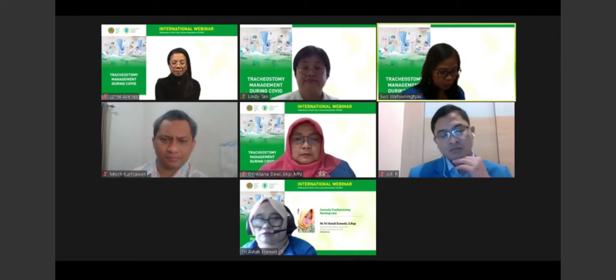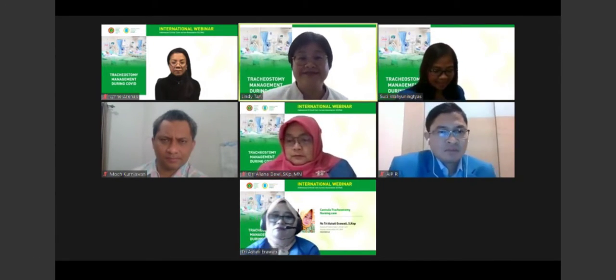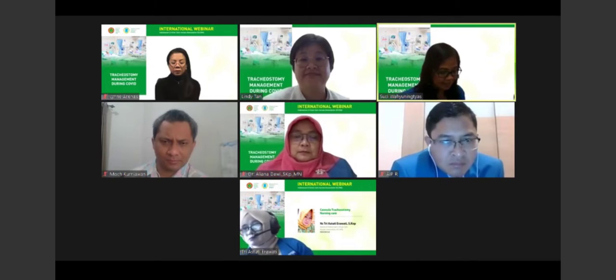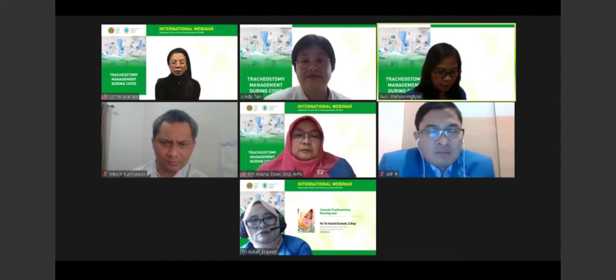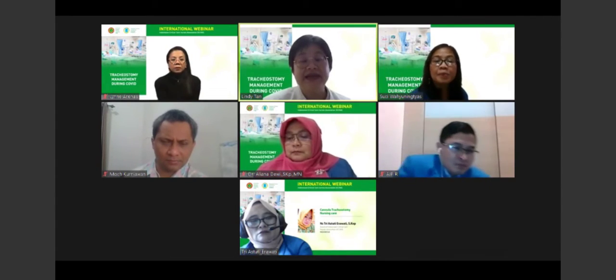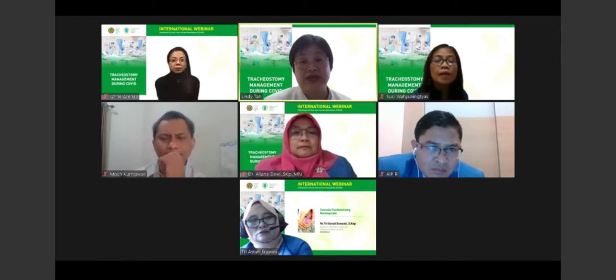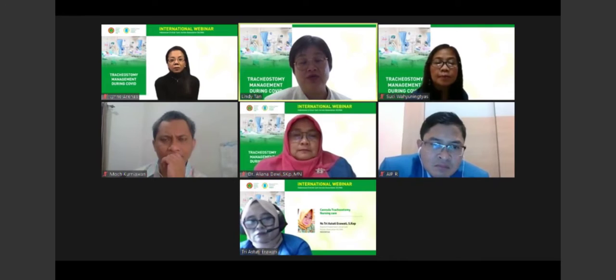The next question is for Dr. Lindy. Hello, Dr. Lindy. This is a question from Erwin Widodo from Malang, Indonesia, in Java. The question is how to minimize aerosol generating procedures in pediatrics with tracheal cannula suctioning. Okay, I think the recommendation from the guideline is to do inline suctioning, that means closed suctioning if possible. If the patient is connected to the ventilator, inline closed suctioning is recommended. That will prevent the aerosol.